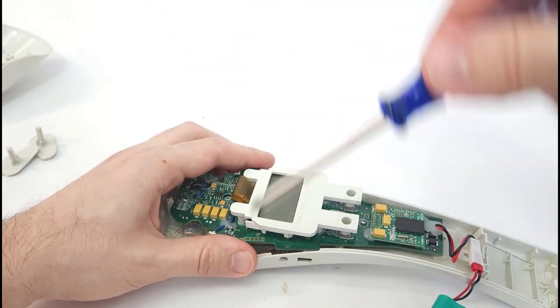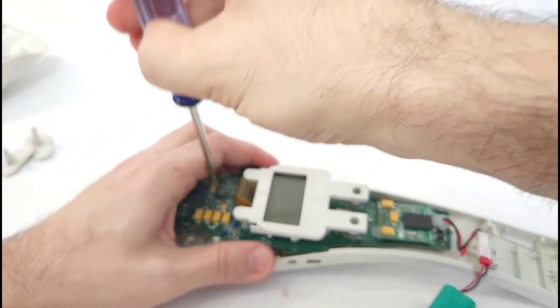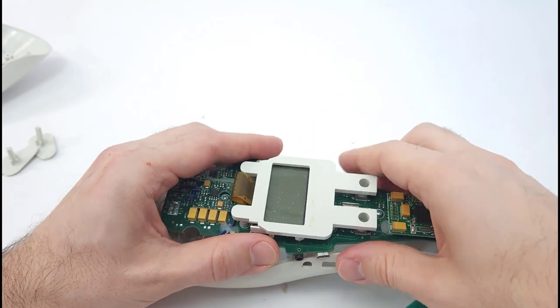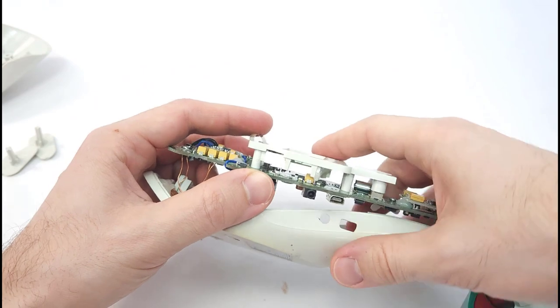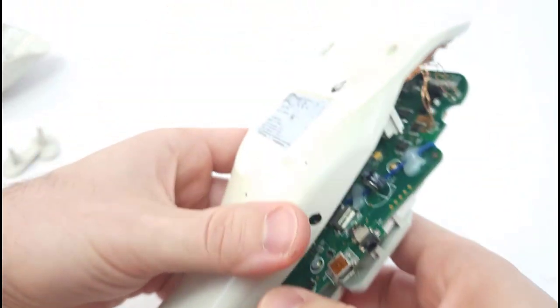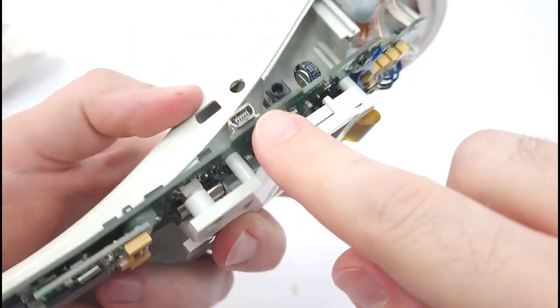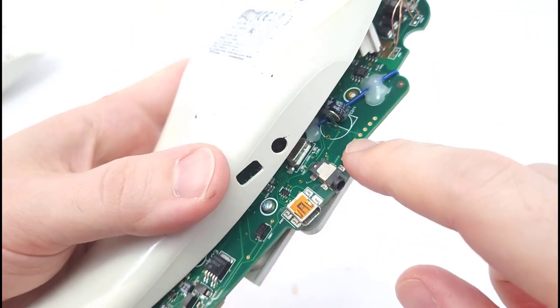Actually, before I put the circuit board back on, I just remembered another failure point I had with the last one. It was also not charging properly, and that came from fatigue on the charging port here. So that is this little jack that, in this case, looks like it's just surface mount, soldered onto the PCB here, not through hole.